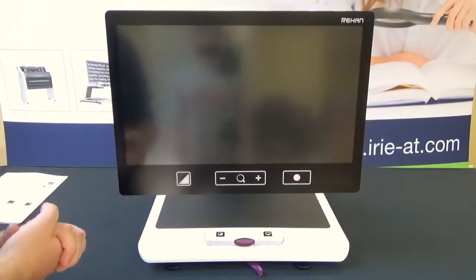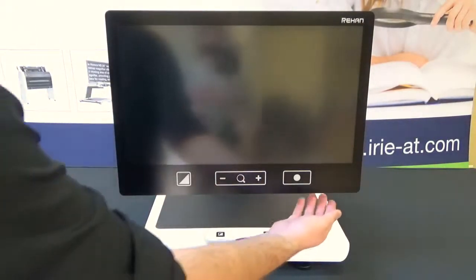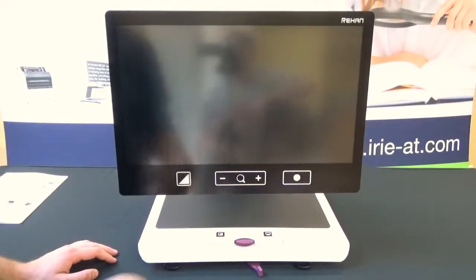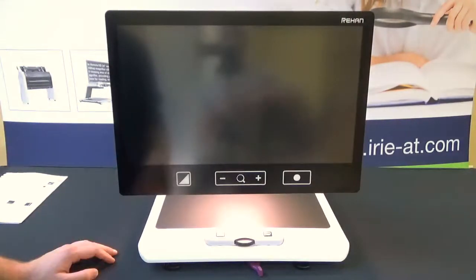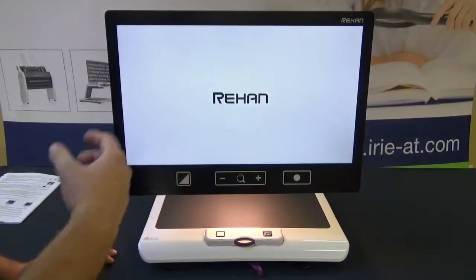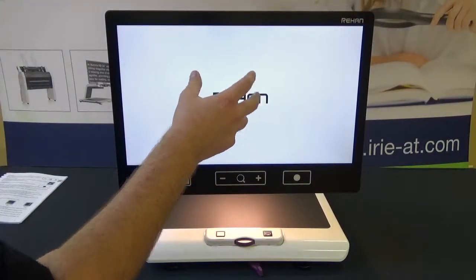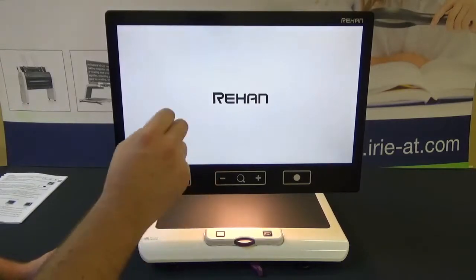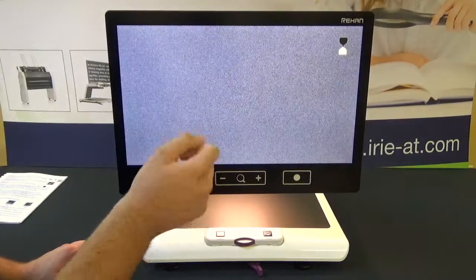Here we are up close with the Acuity 22. So let's go ahead and get this turned on. Underneath the right-hand corner there's a power button — press and hold that for a second. There's a little chime and it'll start to boot up. This is a 22-inch HD display, and when I say HD it's not only a 1080p screen but there's also a 1080p camera, meaning it's true HD all the way through, resulting in a nice crystal clear image at all times.